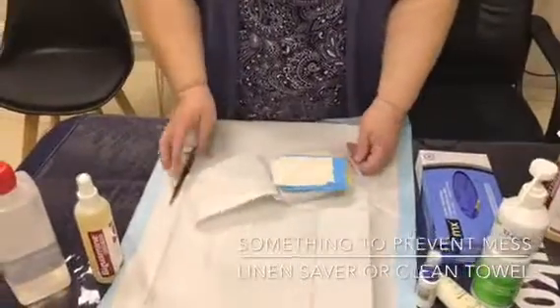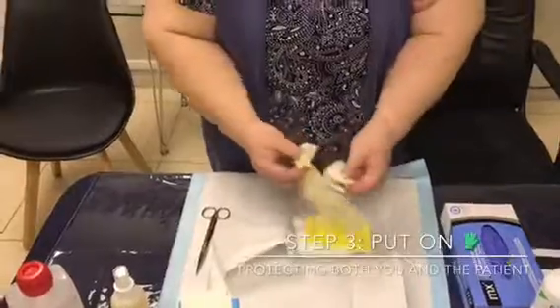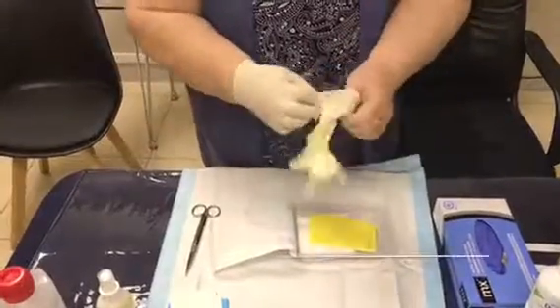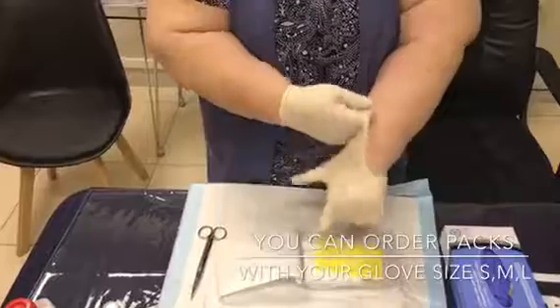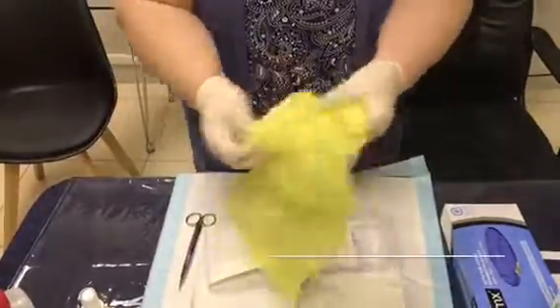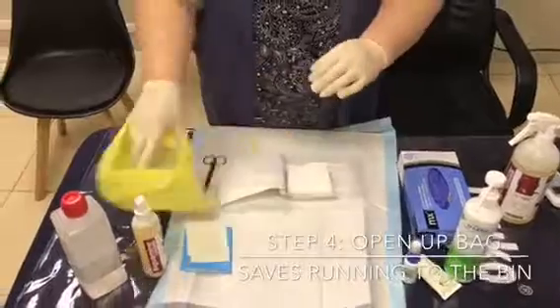I'm going to put on my gloves now. This is not a theater setting, so we don't don gloves the same way as in theater, but we do try not to contaminate them. Make sure the gloves fit you well. You'll also want a little bag next to you for all your debris and dirty dressings.